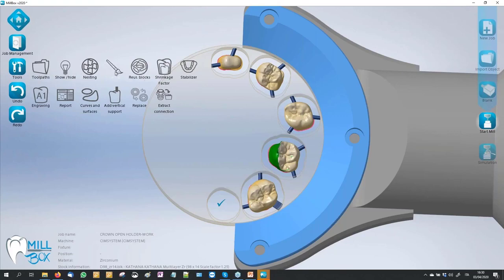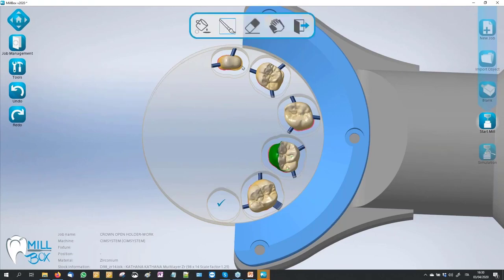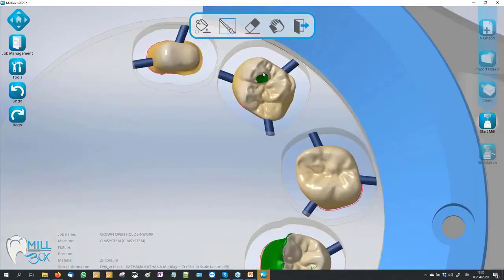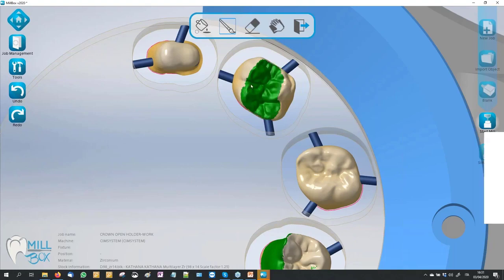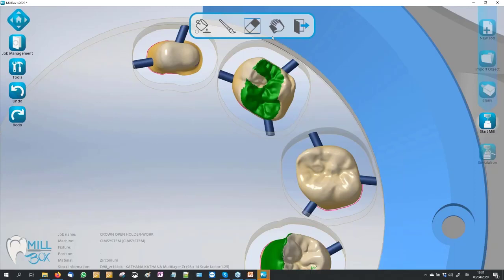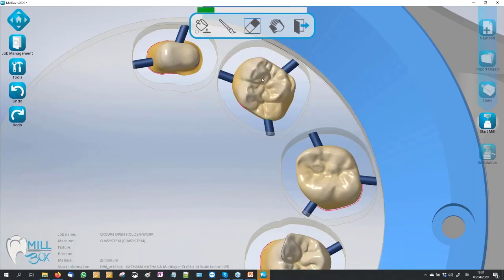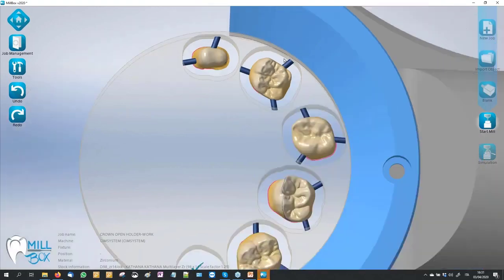Brush: we can paint a desired area on our job to do some special operation only on the painted area. After, when I start the calculation, the software shows options that will be applied only on the painted zone. If we want to delete some painted area, we can select that icon, or if we want to delete all the painted zone we can clean it in a fast way.